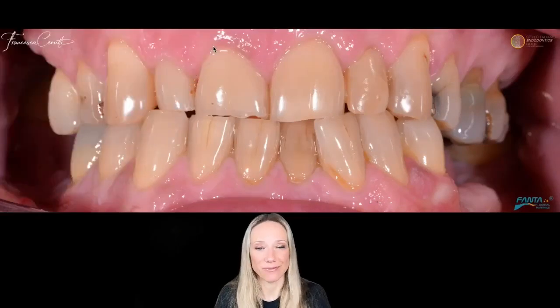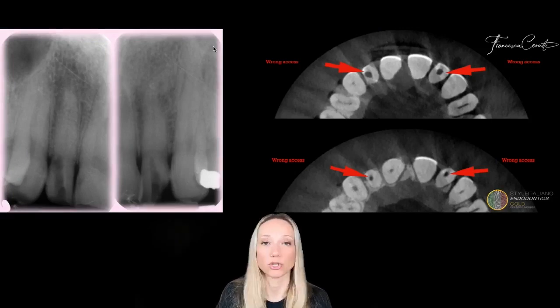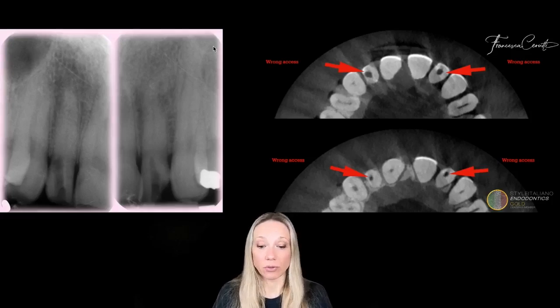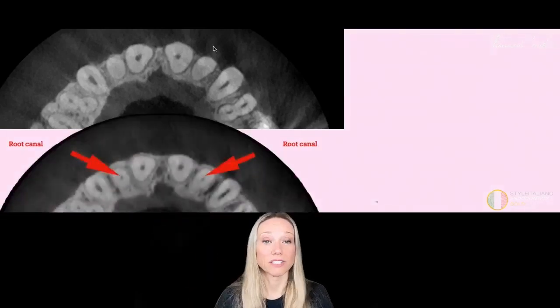The situation is completely different when we encounter retreatments or procedural errors, or some case in which the original anatomy of the tooth has been altered by pathology or by someone who did a therapy before we did. And so in these cases there was a completely wrong access cavity approach, and so the colleague could not find the root canals, but luckily stopped before perforating. I have to manage this case in which you see the wrong access and then nothing. Why? Because the patient was a bruxist, and so there was a calcification of the space of the pulp.